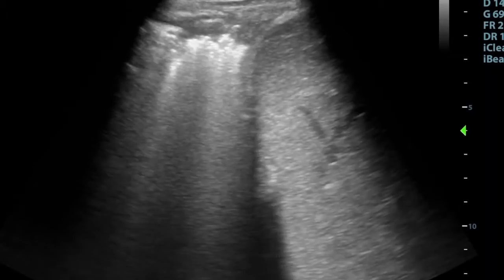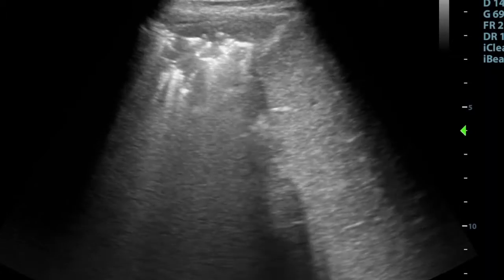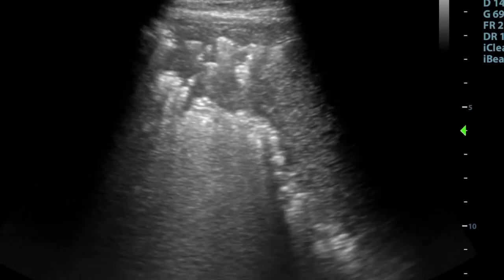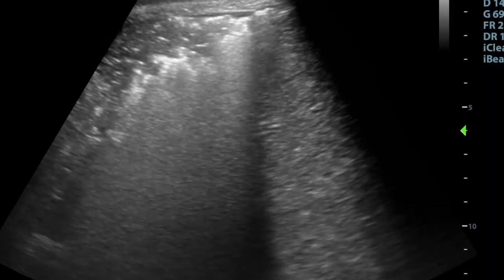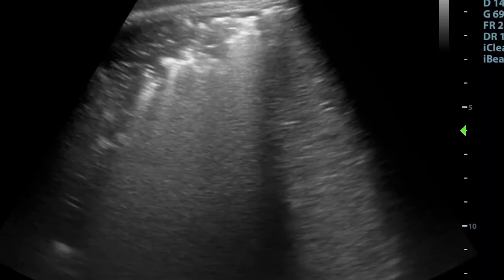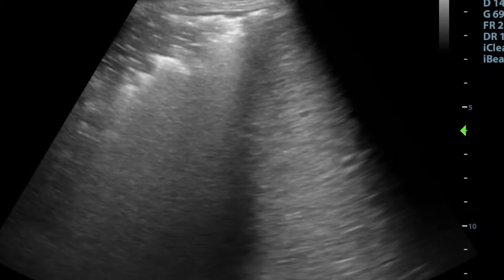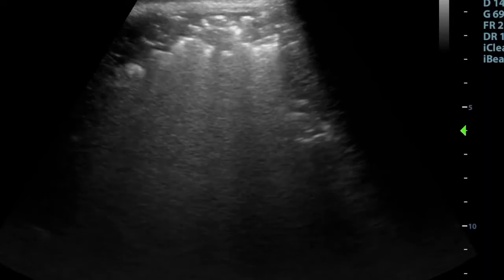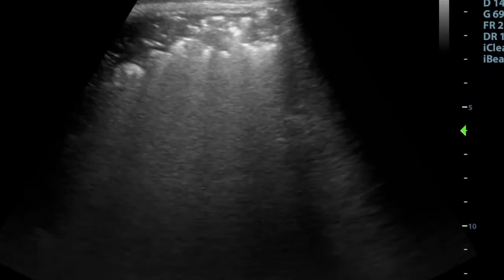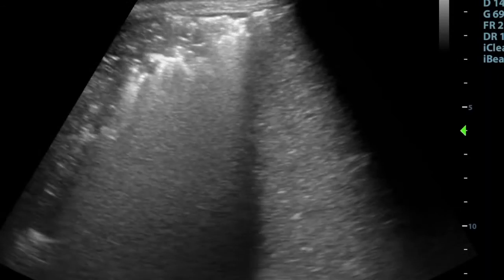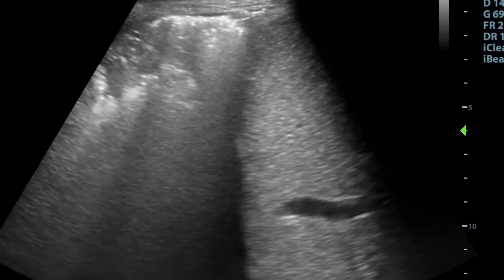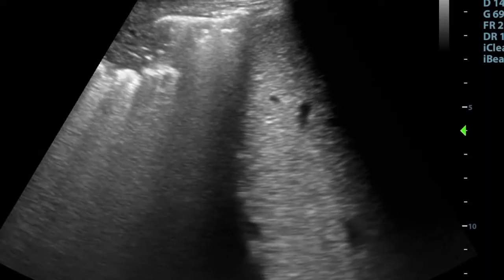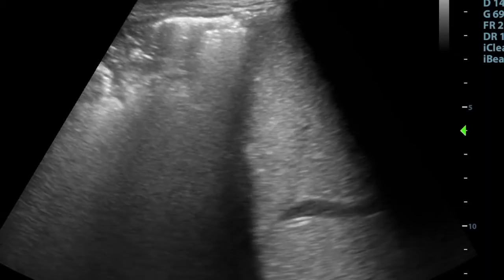We know from looking at pneumothoraces or pulmonary edema that the ultrasound of the lung is all about looking at the artifacts, namely A and B lines. Seeing these on the ultrasound tells us that there's air in the space immediately deep to where we first see them on the screen.